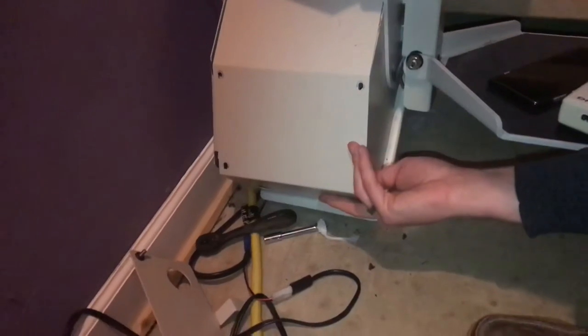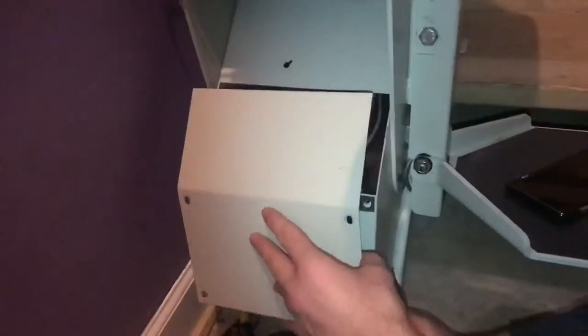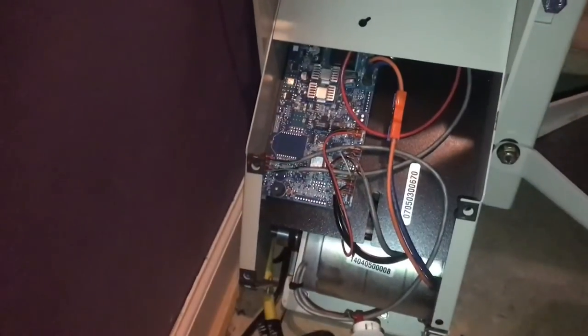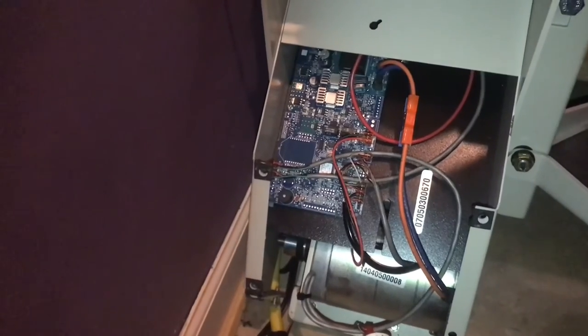We're going to start by taking off this back plate. On the back right here, there's a circuit breaker switch. I'm going to turn that on and wait for the power beep.